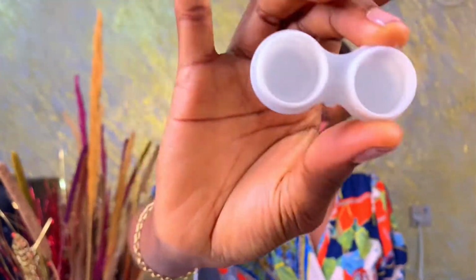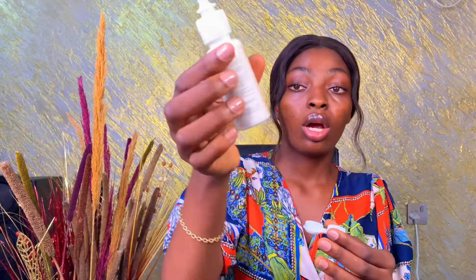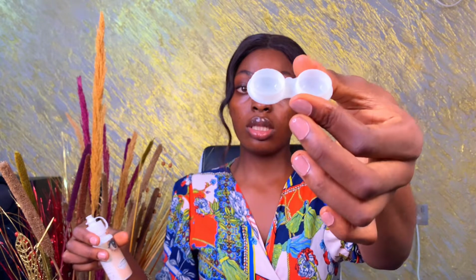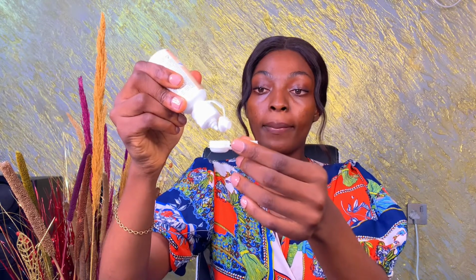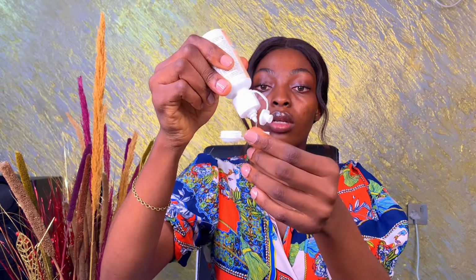The case is clean. You can go ahead and rinse it. You rinse your case and make sure it's free from all dirt, and then I take out my Fresh Look solution, and I'm going to pour it into this container. I'll pour as much as is enough for the contacts. So you want to do this now. Pour in your solution. Pour in the other one.